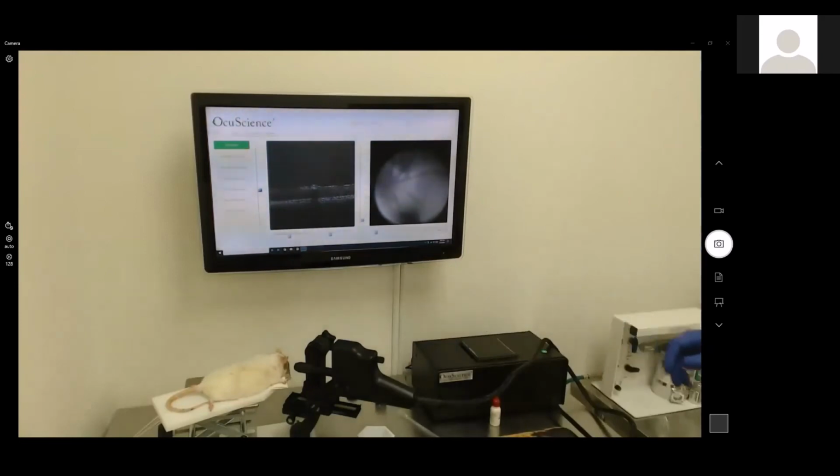For us, we're going to show you a tool that comes with our system. It's called the VQ software, and it will allow you to average and stack certain images together, and also do some colorization using a LUT functionality. So I'm going to pass this over to Sean. He'll go through the VQ, averaging, and LUT, and then we'll also do ImageJ as a tool for doing 3D rendering.